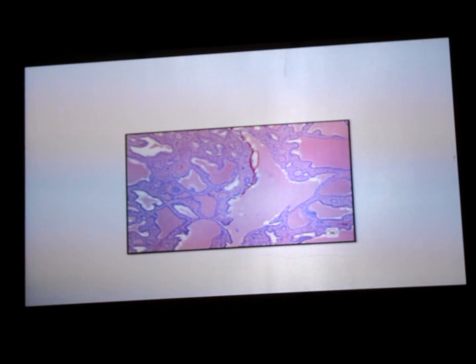Okay. So just to make you more familiar with pictures, what is this organ? Don't hurry. In exam also you do like this. Try to look what is this? What are the systems that we studied today? What were the systems? Renal, okay. Then cardiovascular, then GIT, thyroid.